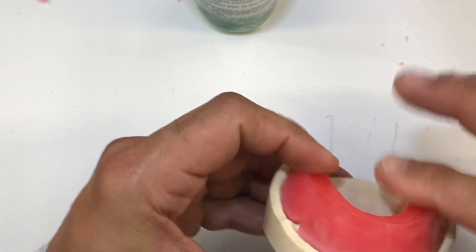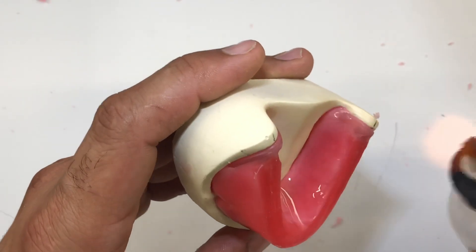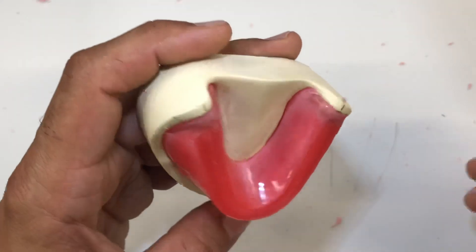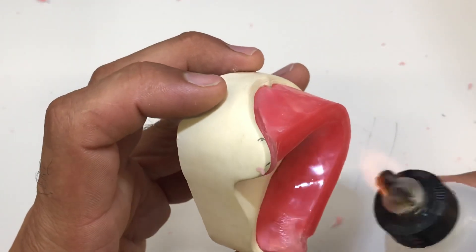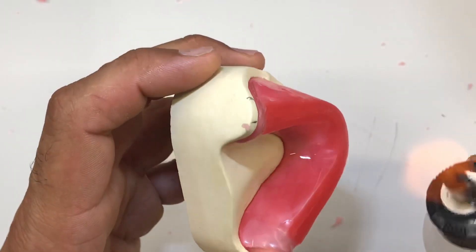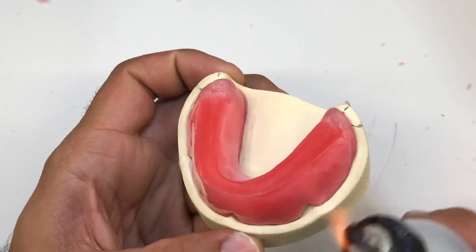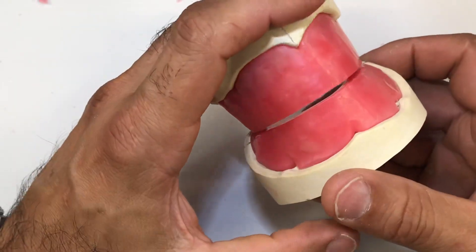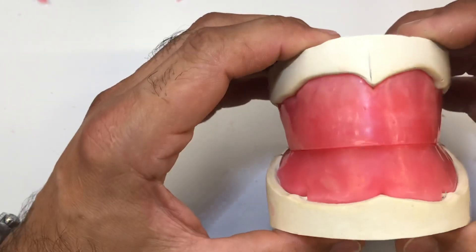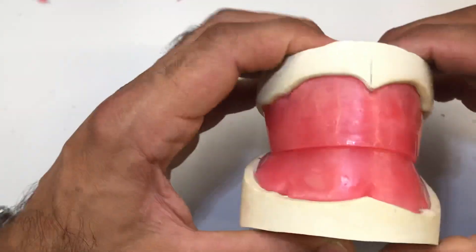I'll put it back on the cast and finish that off. By the time we do a summary of these bite blocks, I'm going to correct this off camera — there are a couple of spots I need to correct. So that's the basic fabrication of complete upper and lower bite blocks, or upper and lower base plates with occlusal rims, in order to achieve the bite registration and go through your maxillomandibular relations with your clients at the next appointment.